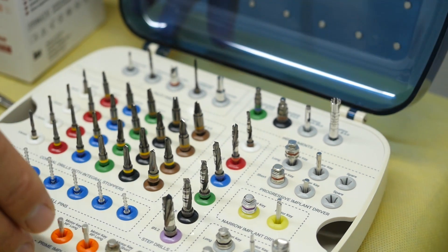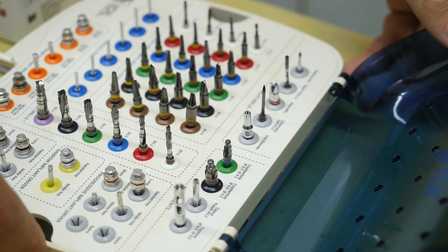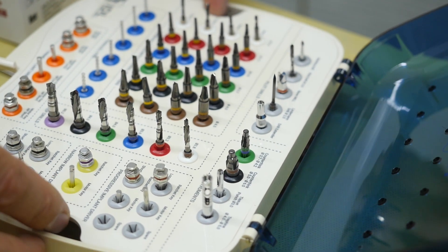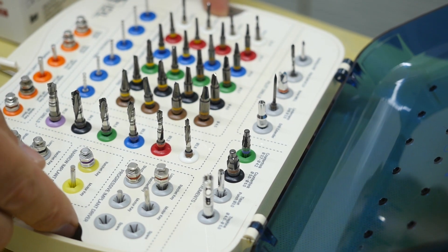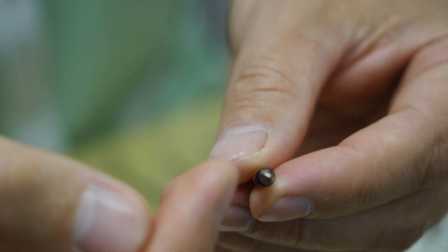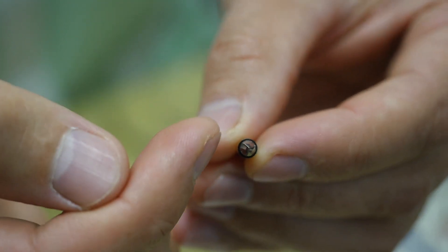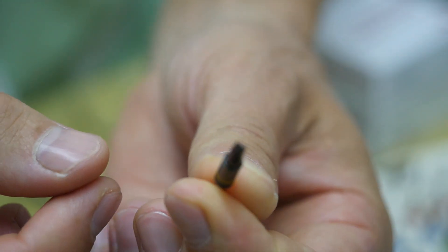DSi All-New Professional Surgical Kit will be used for the surgery. Distinctive characteristics of DSi step and stop drills are a diamond-like carbon coating, along with a stepped shape where the apical and coronal part diameters are different. It precisely mimics the measures of conical taper implant measures.